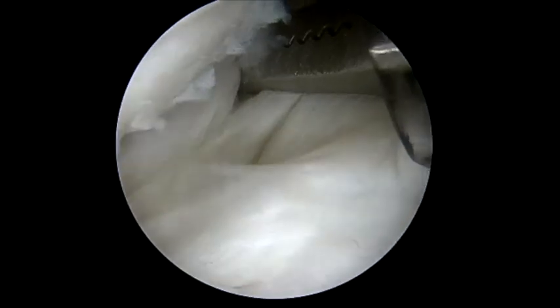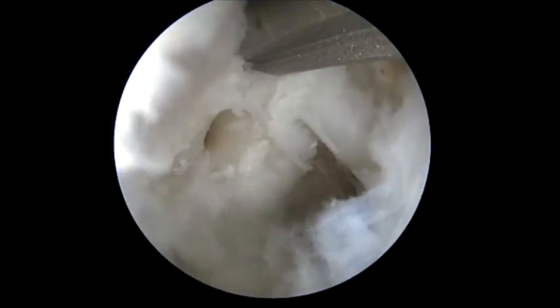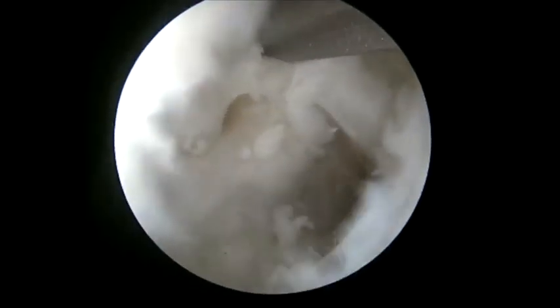You can see we're in lateral position here. Sometimes a 70-degree scope is needed; in this situation it was not. We've done a microfracture hole inferiorly to increase the potential healing capacity.